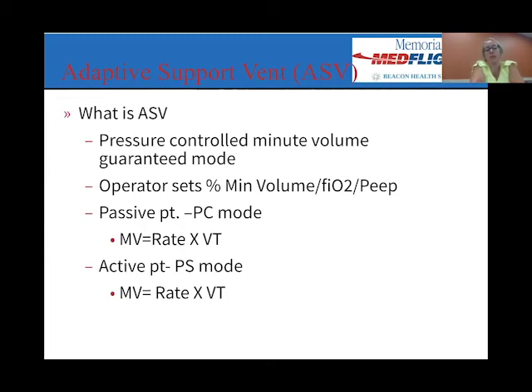It's going to guarantee that you're going to get the set minute volume every single time in that minute, but it's going to adjust, whether it adjusts the rate or it adjusts the pressure, to get your tidal volume that you need so that you're hitting your goal minute volume every single time. In a passive patient, it works more as a pressure control mode.